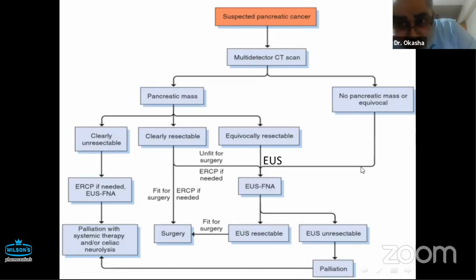So radiofrequency ablation for T1 and T2 pancreatic adenocarcinoma should be done only in surgically unfit patients, and as I think till now as a palliative maneuver, not for cure, because you can't ablate 100% of the tumor without burning nearby normal pancreatic tissue, and this is very serious. But in insulinoma, if you burn about 80% and you have a nice safety margin from the normal pancreatic tissue, then you can get rid of 80% of the patient's complaint. It is an early benign tumor that will not grow again rapidly and will not send metastasis. So it is very nicely applied to insulinomas and not duct adenocarcinoma, except in surgically unfit patients.